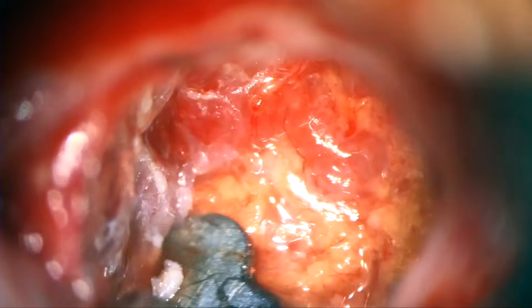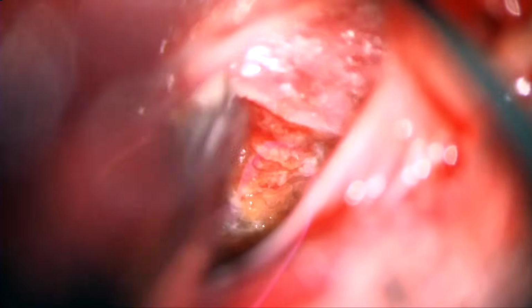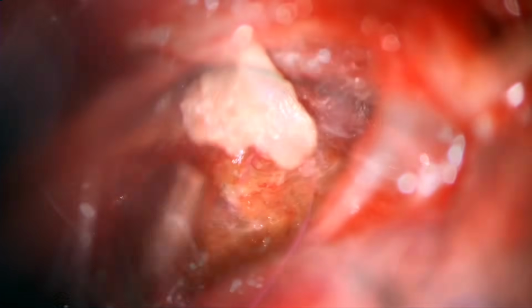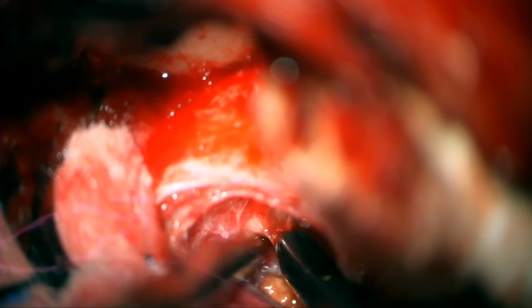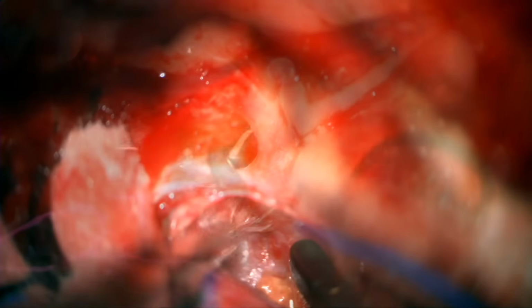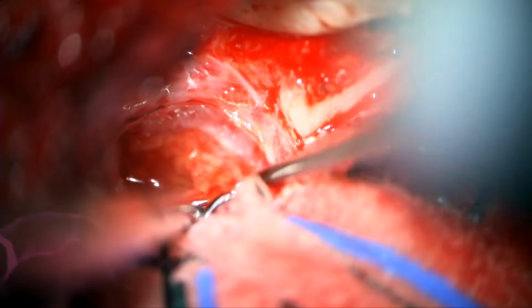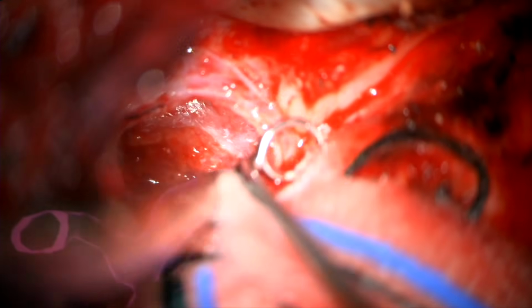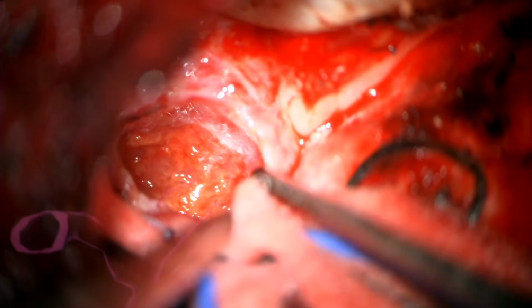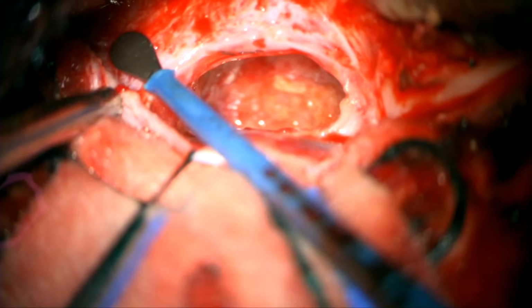There is still a membrane that is stuck to the carotid artery and to the cranial nerves, and that membrane we are not going to remove. The morbidity of doing so is just too high and is unnecessary. We just want to really peel off all the contents, make sure there is nothing left. We irrigate profusely the cavity. We even use the endoscope to take a look at the end also, and we remove any potential residual tumor.